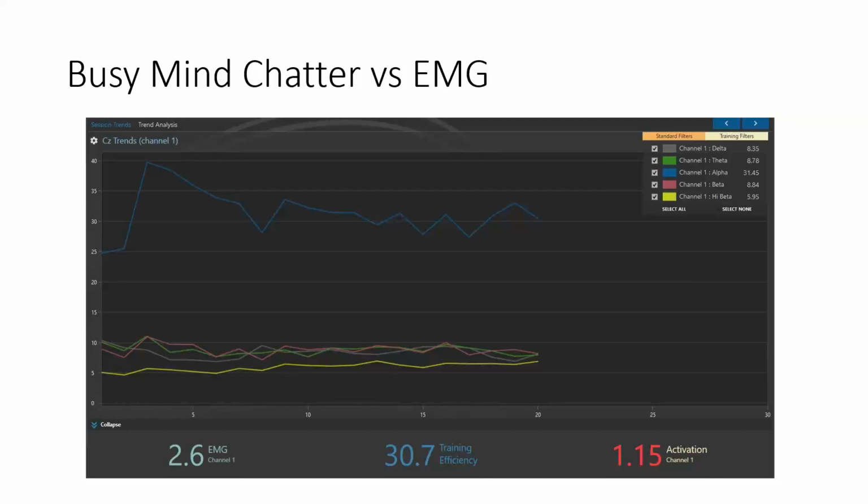We have to be careful with coupling with phase, and we can talk about that. In the higher frequencies, when you have beta, that's going to tend to produce out-of-phase measurements in the EEG. So it's a very pertinent topic as well. I didn't even bring that up, but that is an important thing to think about too.